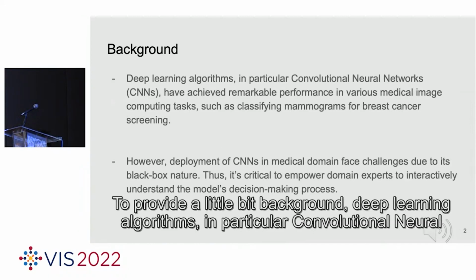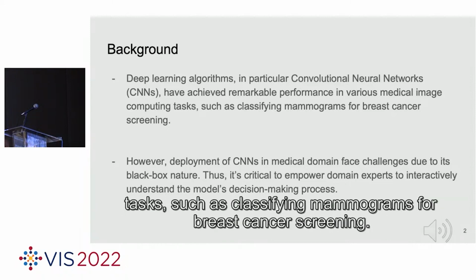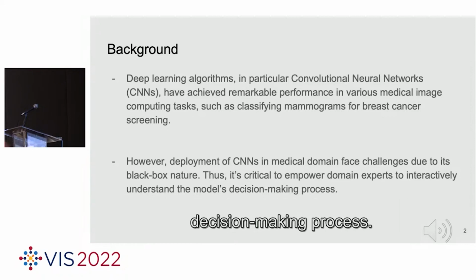To provide a little bit of background, deep learning algorithms, and in particular convolutional neural networks, have achieved remarkable performance in various medical image computing tasks, such as classifying mammograms for breast cancer screening. However, deployment of CNNs in the medical domain faces challenges due to their black box nature. Thus, it's critical to empower domain experts to interactively understand the model's decision-making process.